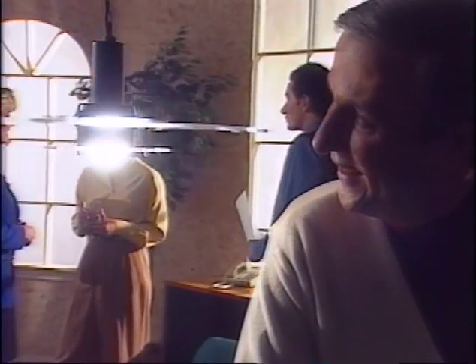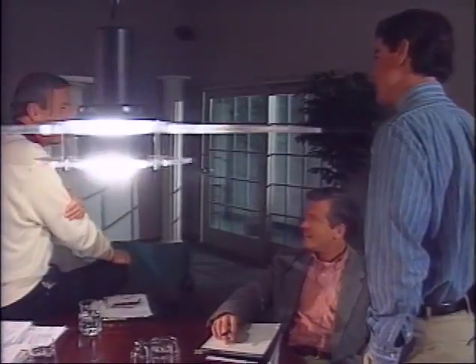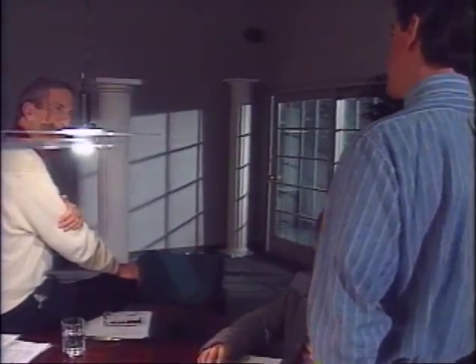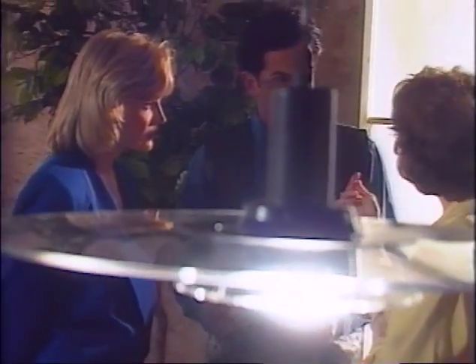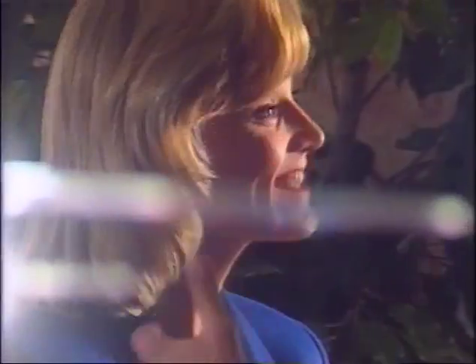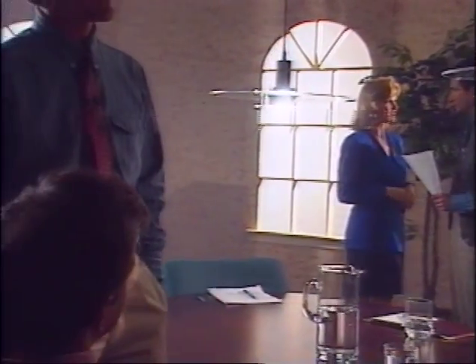Several years ago, CYBEX made a decision to develop a new type of testing and rehabilitation system, a system that doctors and clinicians would recognize as essential to their practice and their patients. It had to be affordable, compact enough to fit any size facility. It had to reduce the time needed to set up a patient, have an easy-to-use software package, and efficiently access patient information. We've asked a few physical therapists to join us for a private introduction of our new system.